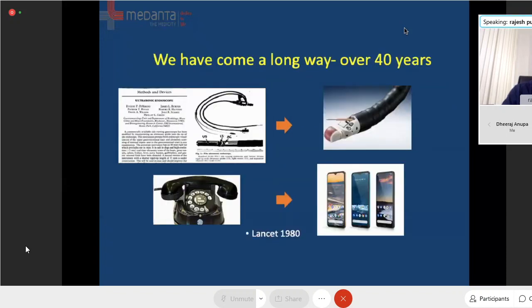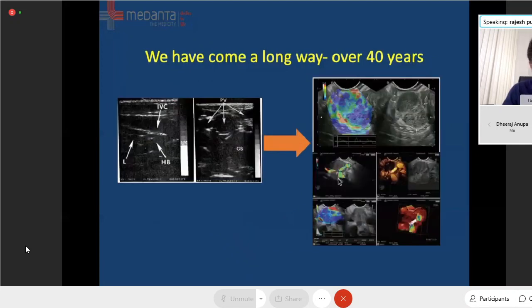practice. We have come along 40 years from the large scope which could produce pain in the hand and the neck to the best available scope in the world, like the telephone which was situated at home, and we now have decent mobiles which are an integral part of our day-to-day life. So I think endoscopic ultrasound is an integral part of GI practice.